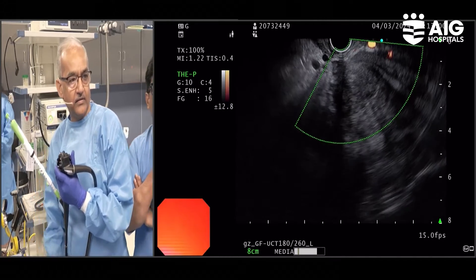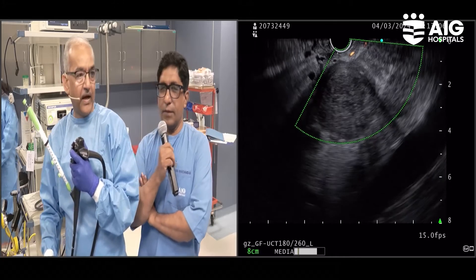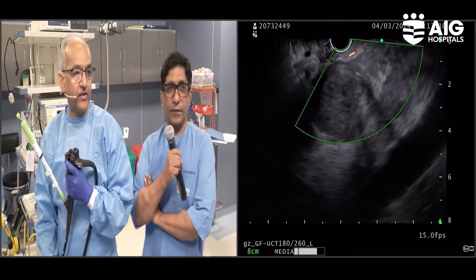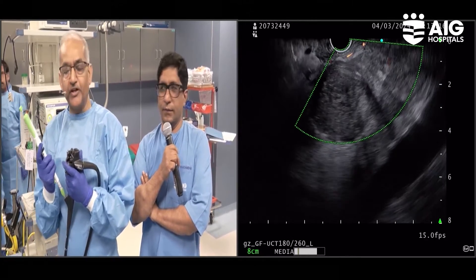We have another technology here which can be competitive with the ROSE technique, with much more accuracy. The image quality we saw in the previous case — let's hope we get a similar result — that will be a game changer on its own, I think. Once this becomes the standard of care, the quality of image is outstanding.